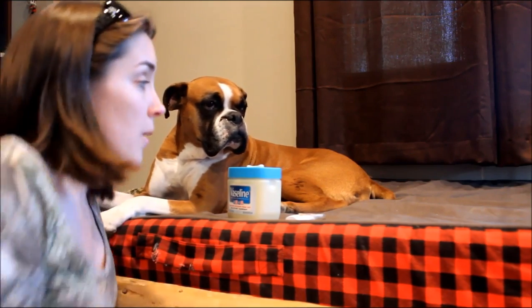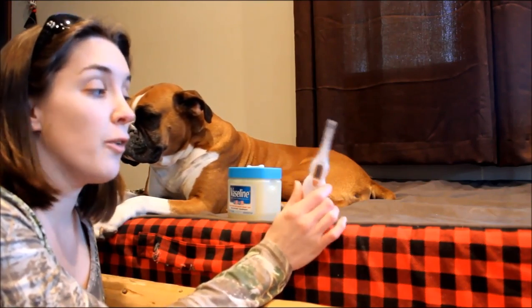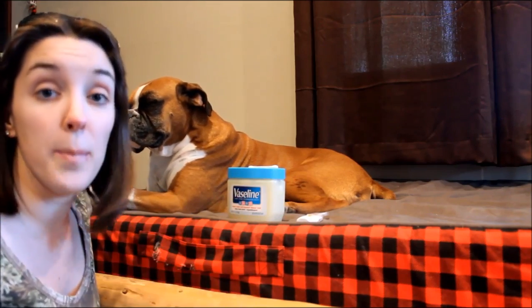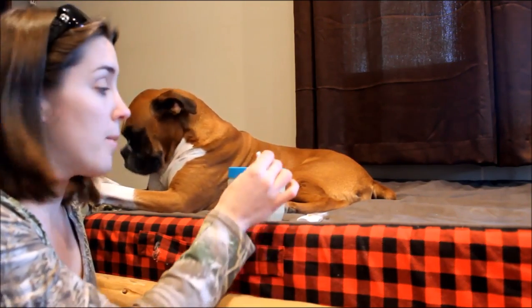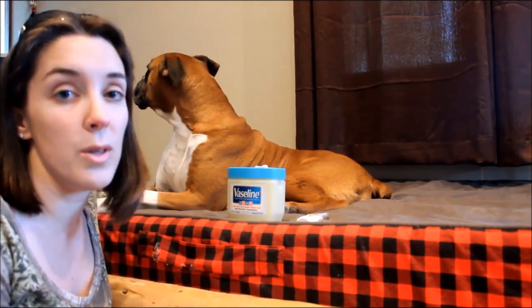You want to have a separate thermometer for your dog. I recommend a digital one — they're the safest, most accurate, and easiest. We keep ours right in our dog first aid kit so we know where it is and there's no chance of it being accidentally used on humans. You'll also want some kind of lubricant like petroleum jelly or baby oil, and I use a Q-tip to smear it on the thermometer so it doesn't get all over your fingers. Those are the only three things you'll need.